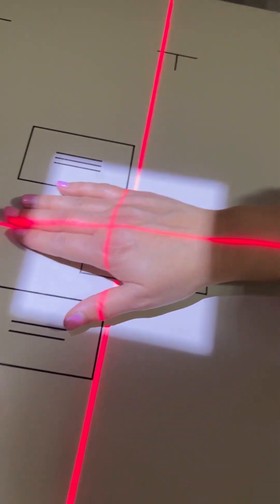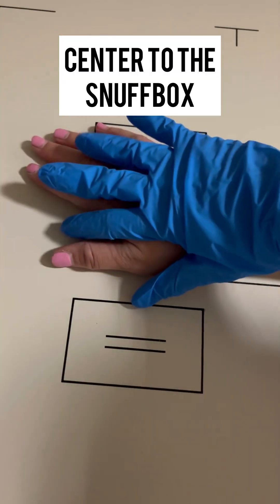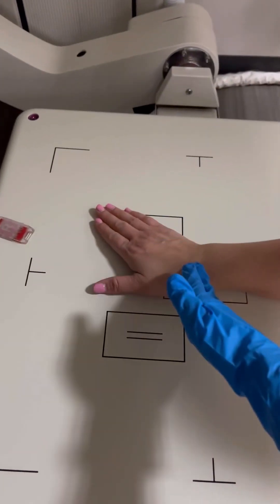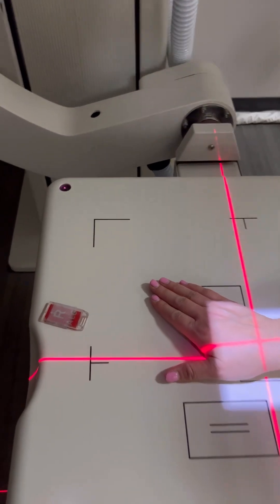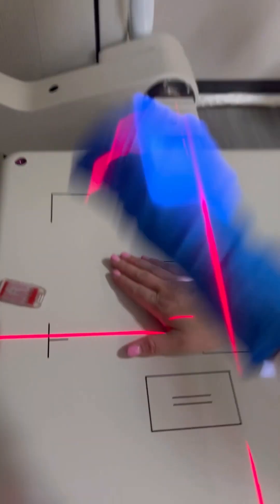What you would do is put your wrist like this and then you would do an ulnar deviation. Because the angle of it is coming this way, that's going to open up that joint space to see the scaphoid.